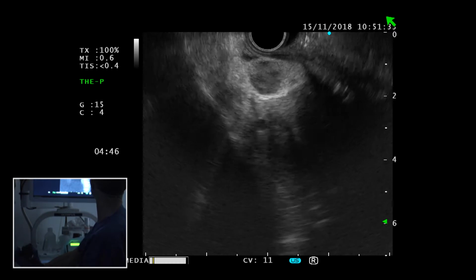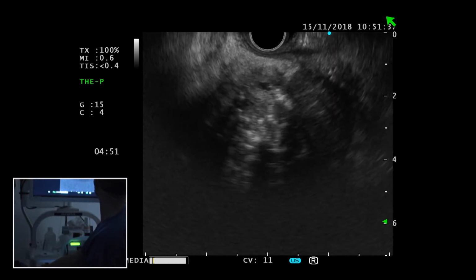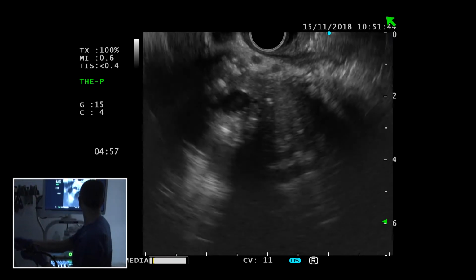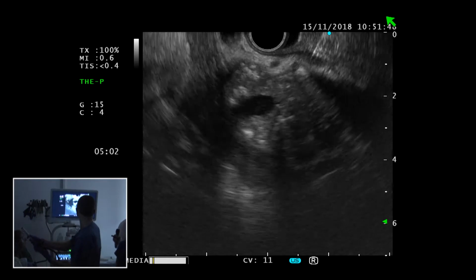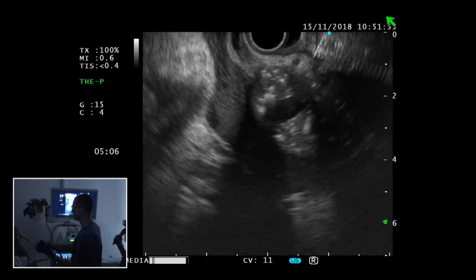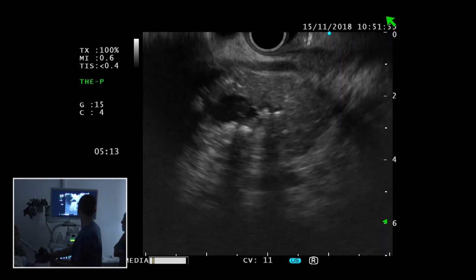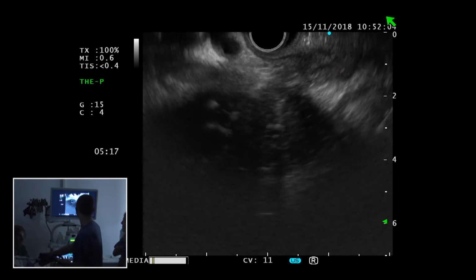It's a biopsy. So people are asking which size of needle you are going to use. 25. Okay, 25, the smaller. Is there any different opinion on that? I think it's better to try to perform a fine needle biopsy, not fine needle aspiration, in this case. So, Thomas, is that a fine needle aspiration needle or a biopsy needle? This is a fine needle aspiration. Okay.